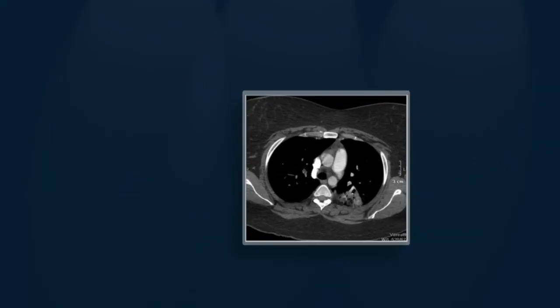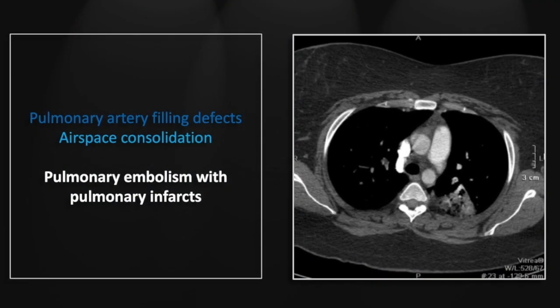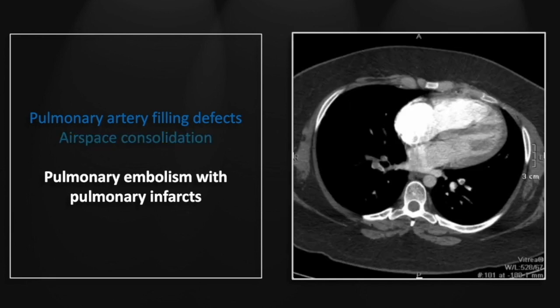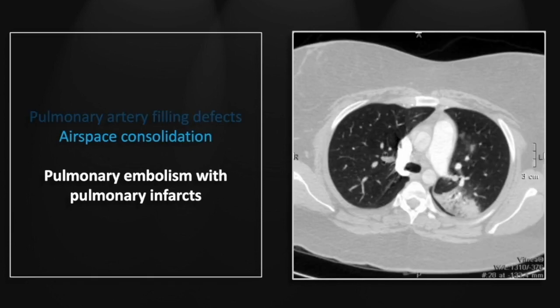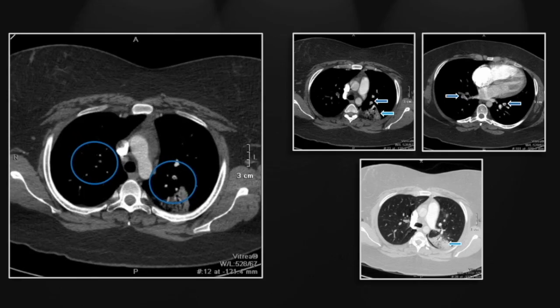Our next case is a pulmonary embolism with multifocal pulmonary infarcts. The filling defects are present in multiple pulmonary arterial branches, and there are multiple wedge-shaped peripheral regions of consolidation consistent with pulmonary infarcts. Filling defects are again seen in the lower lobes, and there is interventricular septal straightening consistent with right ventricular strain. On the lung windows, well-demarcated peripheral consolidation consistent with a pulmonary infarct.